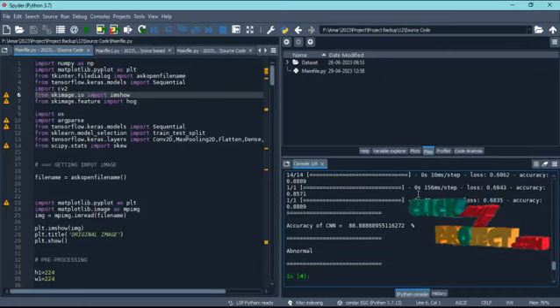After the feature extraction, the classification results will be displayed like this. If the input is normal, the classification result will be displayed as normal. In case the input is an abnormal image, the classification result will be shown as abnormal. Here we have taken one image, that is an abnormal cell image. So the classification result shows as abnormal.